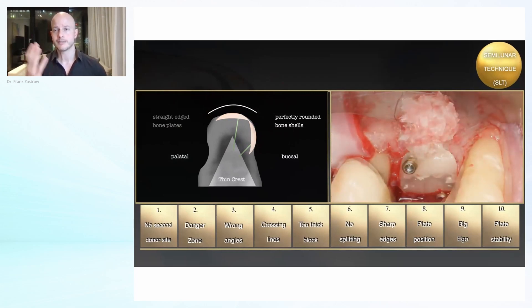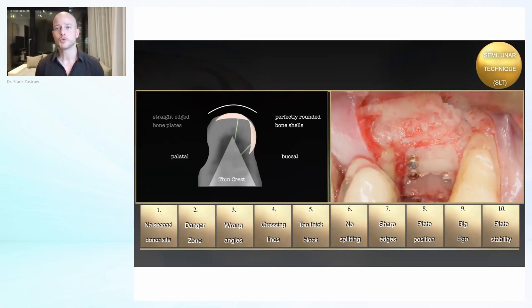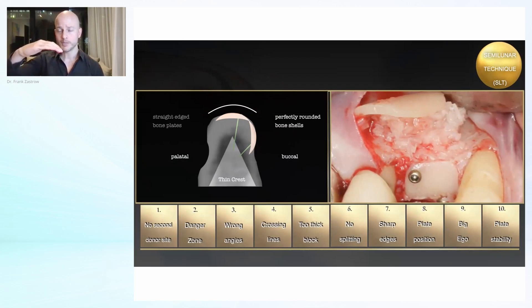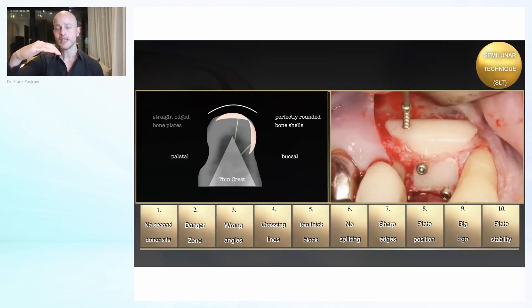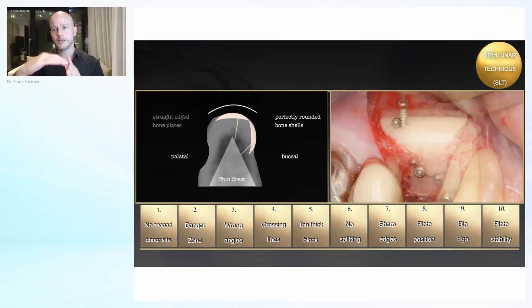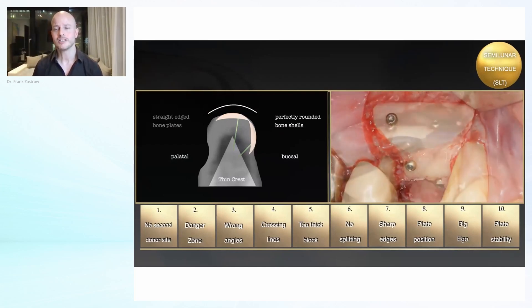Multi-center studies are planned, and if you are joining our education, we might even do some research together. You see now our first rounded shell placed occlusally, filling the space with the chips — always the same concept — then placing our shell on the buccal side.